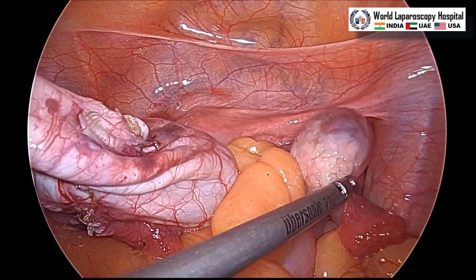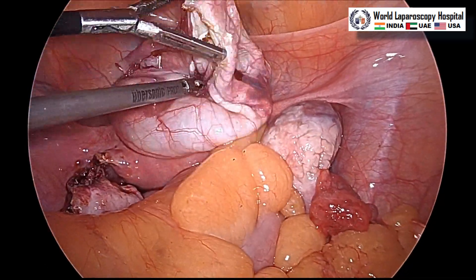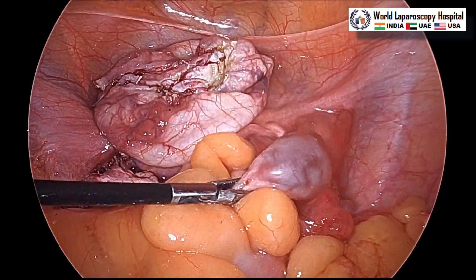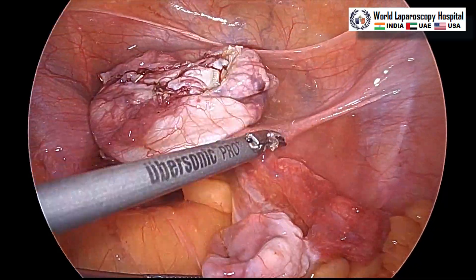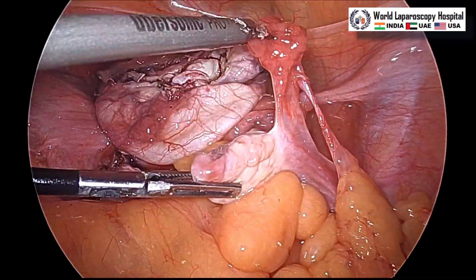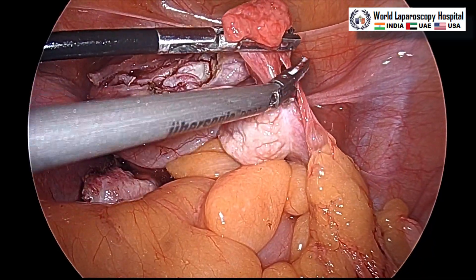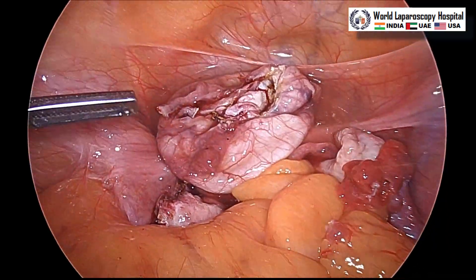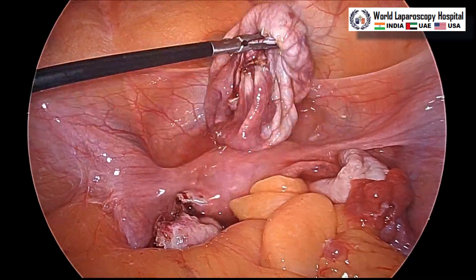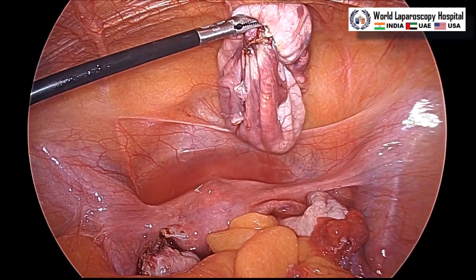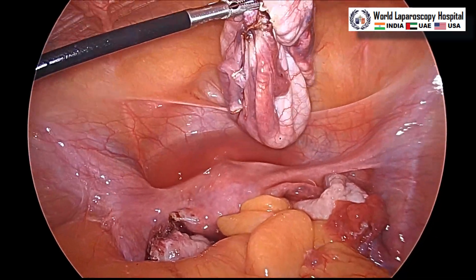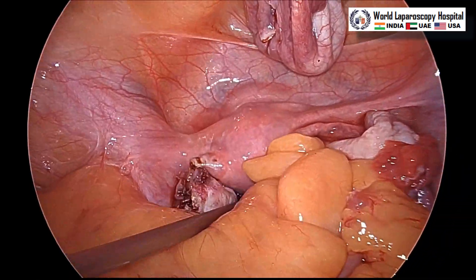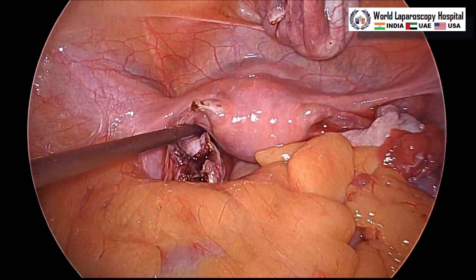We will remain 6 mm away from the uterus and cut the tube to prevent any uteroperitoneal fistula and to seal the tubal end. There is a follicular cyst on the right ovary which we will also puncture. The cyst is kept over the anterior cul-de-sac. The follicular cyst is punctured; the right tube and right ovary are fine with a little adhesion at the fimbrial end. After that we will start sucking the fluid that leaked out of the cystic wall.